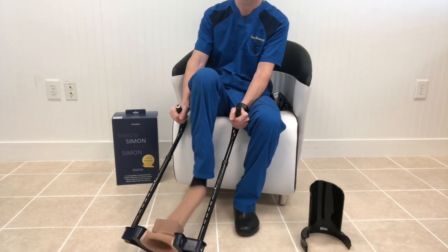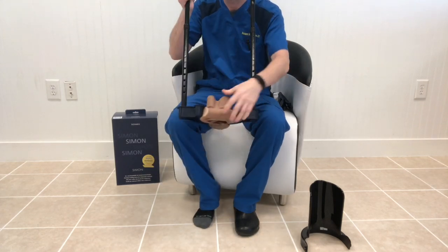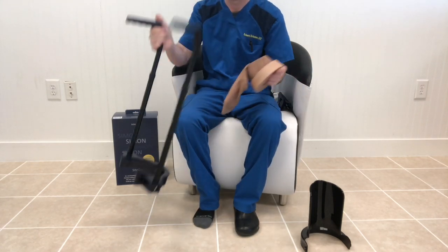Now you just push the device away and pull back with the leg. Remember to use your leg muscles to pull as much as you're pushing to get the compression sock off.